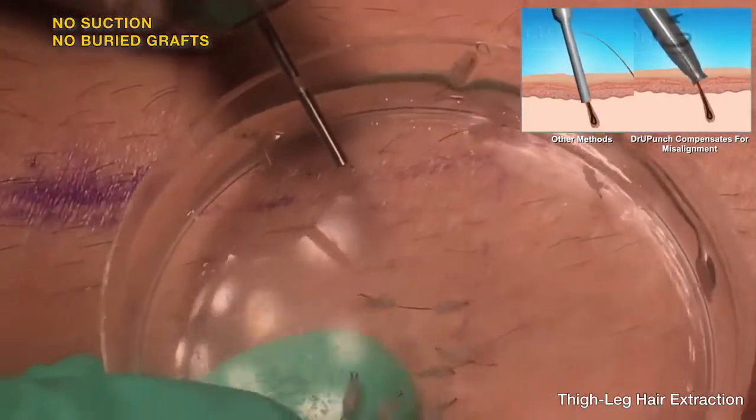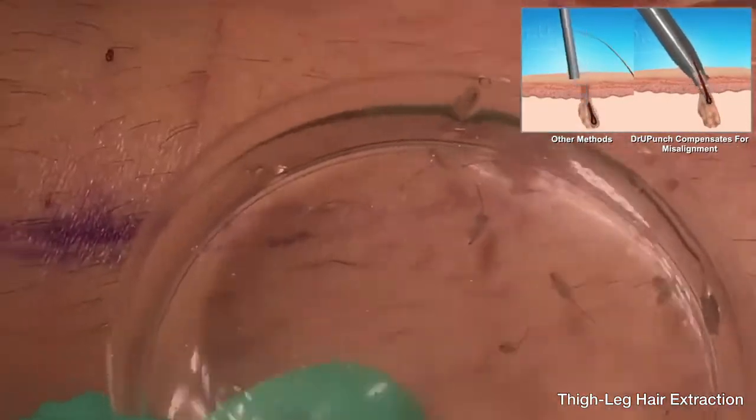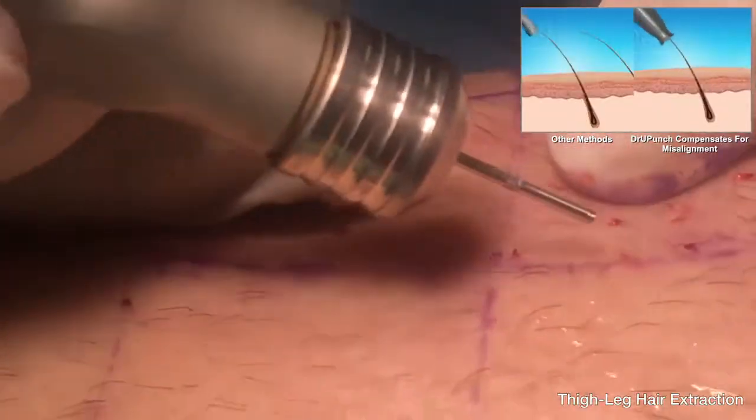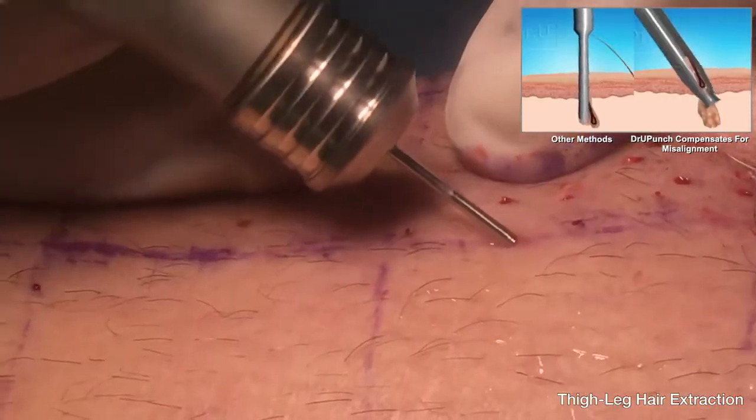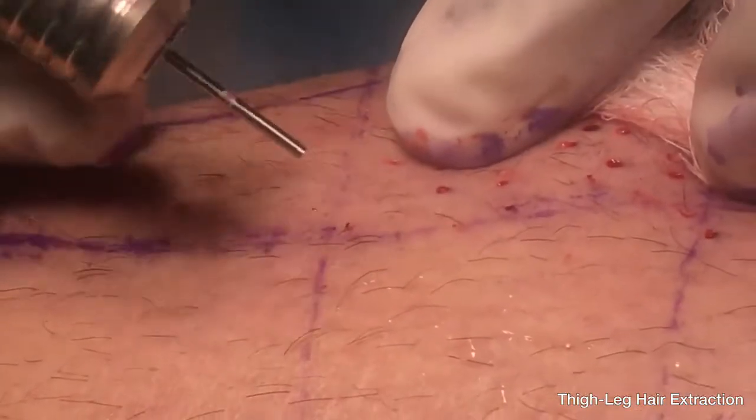Even if the practitioner is to mal-align it a little bit, as we will demonstrate — this hair is going one way and the practitioner is coming a different way to deliberately mal-align the punch — still, the graft comes out intact.